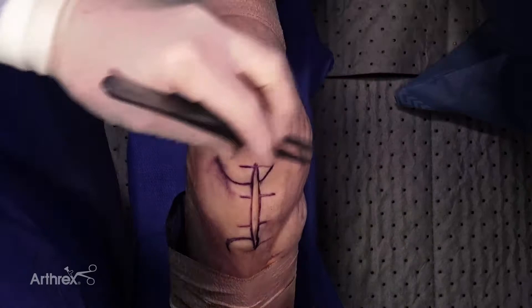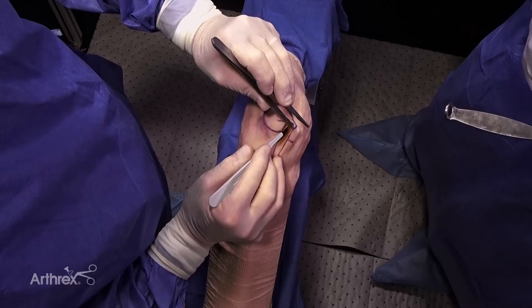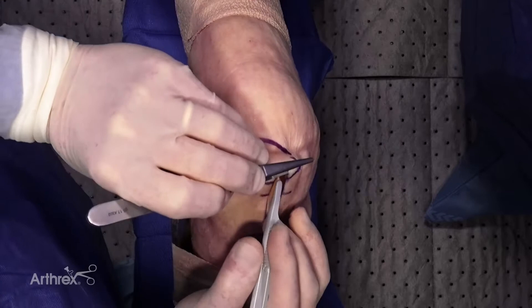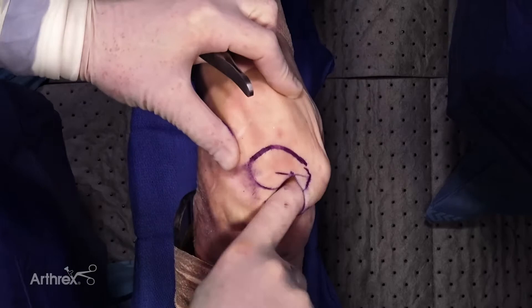Usually we have a tourniquet up so there's very limited bleeding. Keep the incision fairly small. Don't do a lot of pinching of the skin edges, just for healing and trauma, so oftentimes I'll just use one edge of my forcep to do that. I only undermine up here because I'm going to keep my incision small, but I'm going to gain a lot of exposure by just feeling the patella, the inside aspect, the medial border of the patella, and then create a little bit of space there.